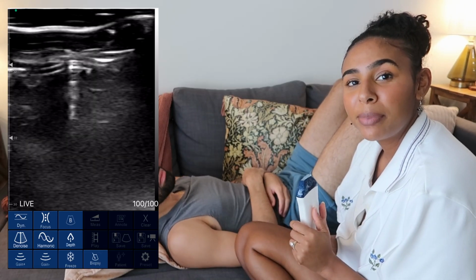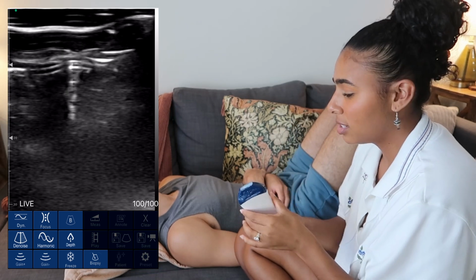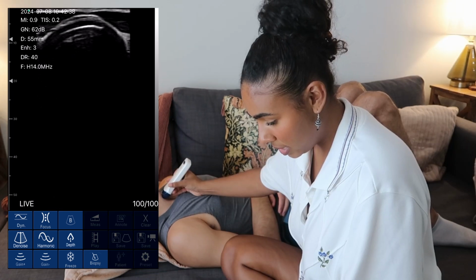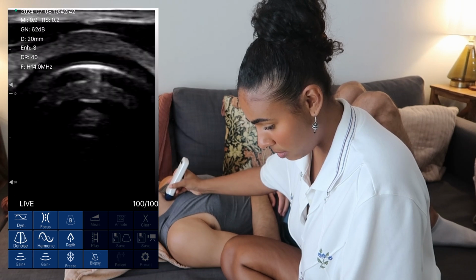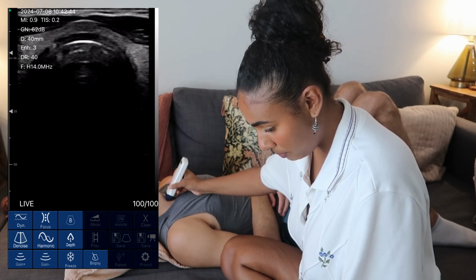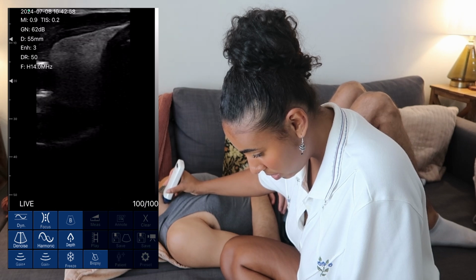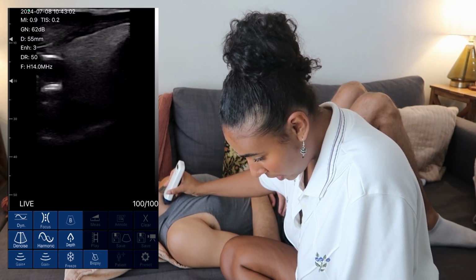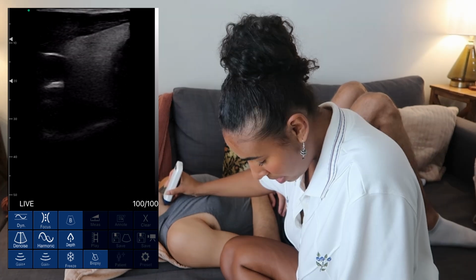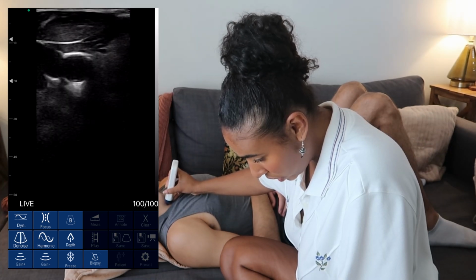Lastly, I'm going to show you a little bit of thyroid and his carotid area, just so that you can see how this looks on small parts. Let's change our depth so we can see more of his thyroid. Changing my dynamic range just so that we can have a little more contrast. And here we have his right thyroid. I'm sweeping superior to inferior in transverse.